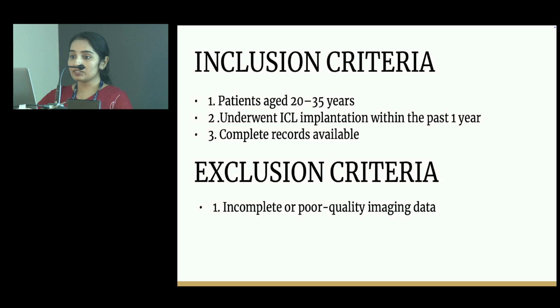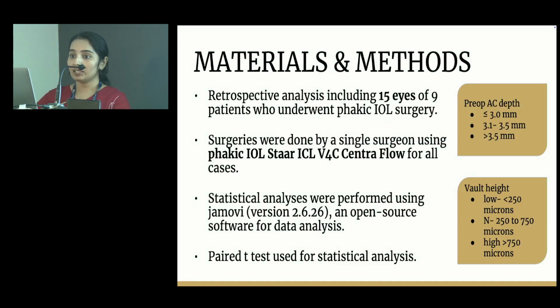The patients aged 20 to 35 years who underwent ICL implantation within the past 1 year, whose complete records are available, are included in the study. And since only young patients after exclusive screening are selected for phakic IOL implantation, the only exclusion is those with poor quality imaging data.